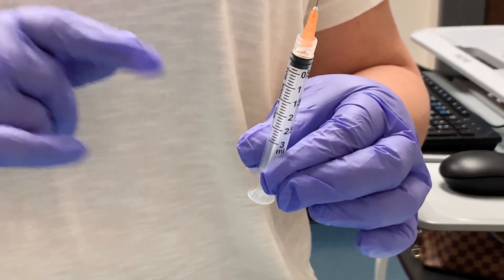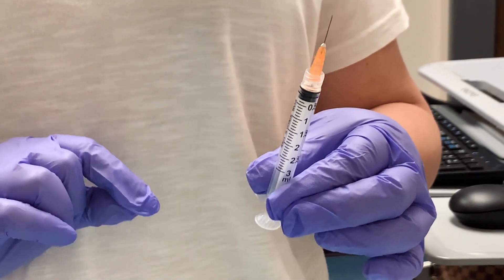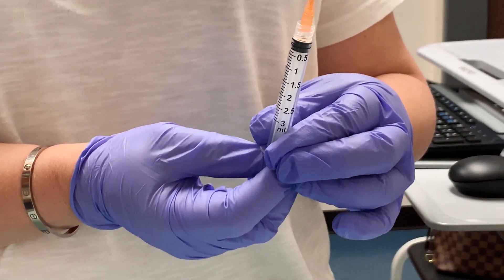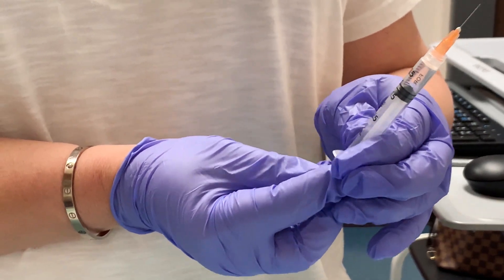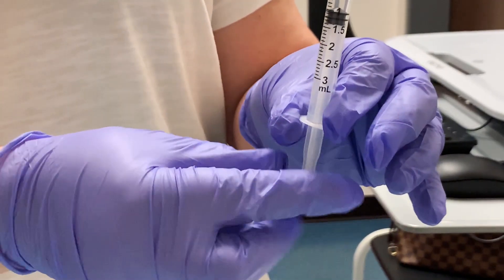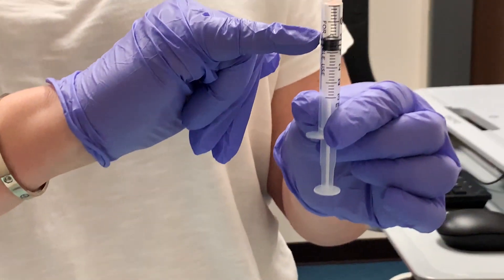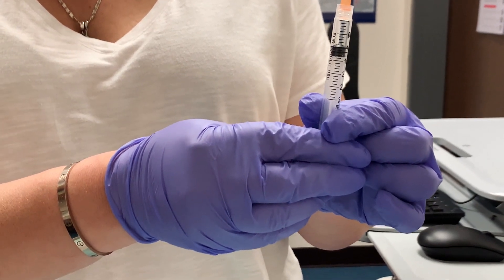For this injection I'm going to inject half a milliliter. What you want to do is pull back an equal amount of air and push it into the vial for the amount of solution you're going to withdraw. It's a good idea to pull back a little extra so that if you have air bubbles you can push them out without being under-dosed. Since I need half a mil at the end, I'm going to pull the plunger back to about one mil. The measurement is taken from the top black line of the plunger.